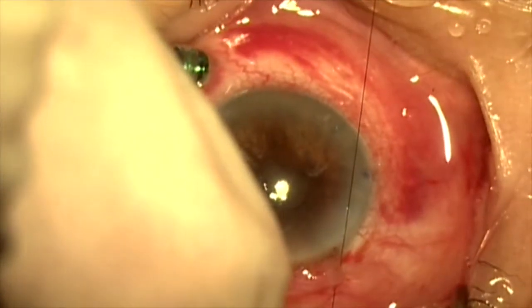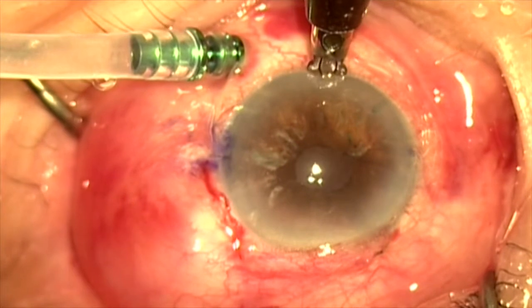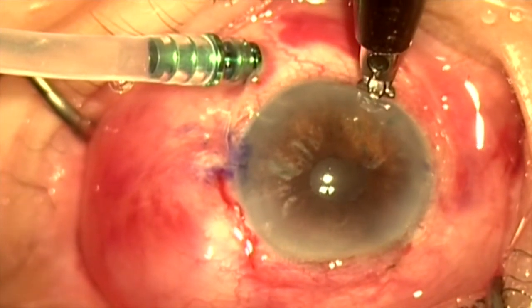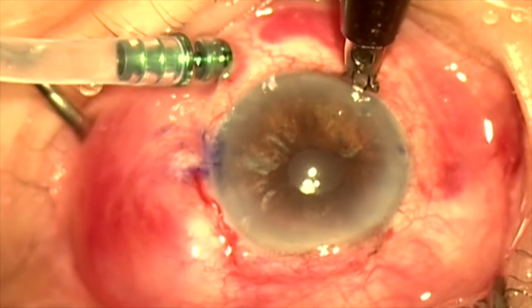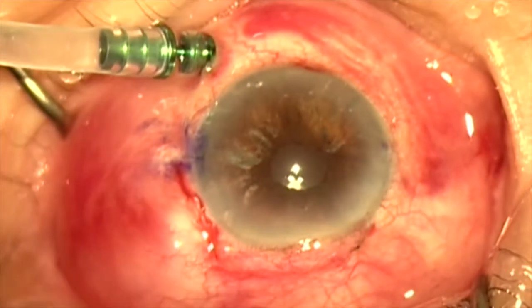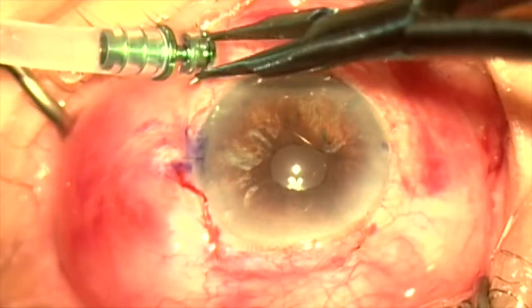We're not going to suture the scleral incision as it's on the steep axis. We're just going to close the conjunctiva with 10-0 nylon. This is a limbal relaxing incision placed on the steep axis as per the surgical plan. The trocar is removed and the case is completed. Thank you for your attention.